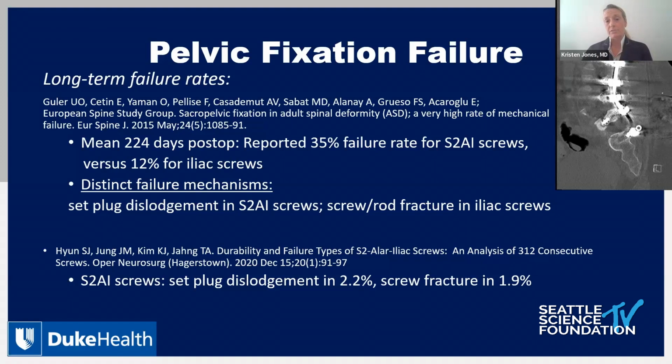So you might see loosening that's asymptomatic, large halos around the screws in a patient that's doing fine. And most of us would say we wouldn't do anything to revise that. Or you might see a patient who has pain that you can't really block out well with various diagnostic injections and who has haloing around the pelvic fixation. The question is, is that symptomatic pelvic fixation failure? And we don't define that by a standard definition right now, but that's certainly going to be something important with time.